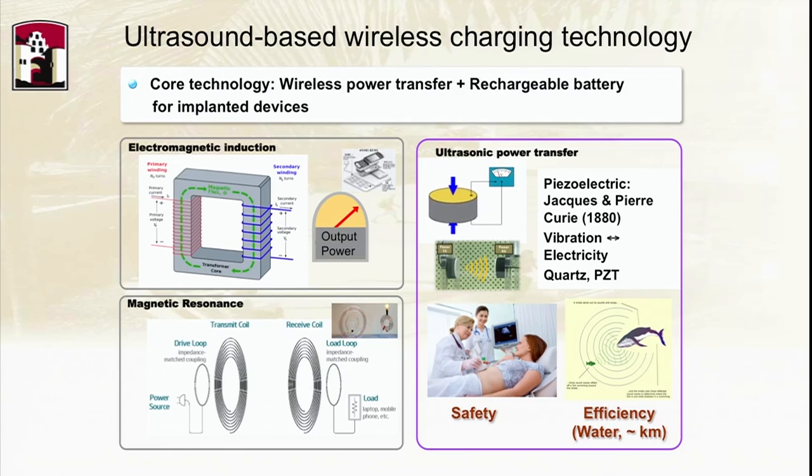Thank you, Yusuf. As you say, Yusuf is an electrical engineer, and I'm a mechanical engineer, and you might wonder why you guys are doing neuroscience. We are not the scientists, we are engineers. So we talk about the device, and the device I'd like to talk about is wireless charging. We now have a beautiful brain-computer interface that we can implant inside the brain.